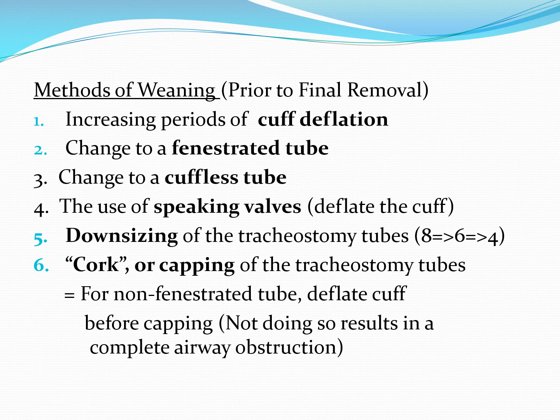Now let's focus briefly on weaning prior to final removal. So increasing periods of cuff deflation and liberation from mechanical ventilation as well. We're really not talking about mechanical ventilation weaning, we're talking about weaning them off of the tracheostomy tube, but one follows the other.